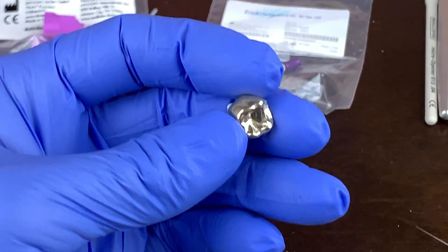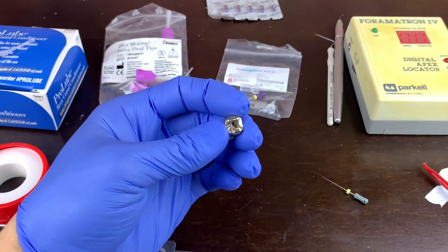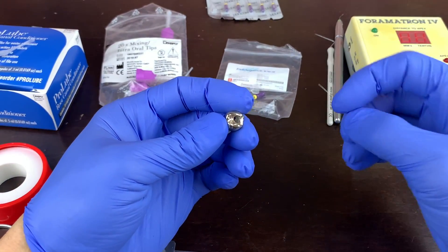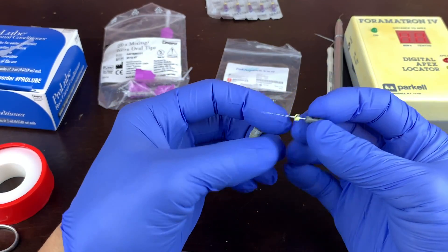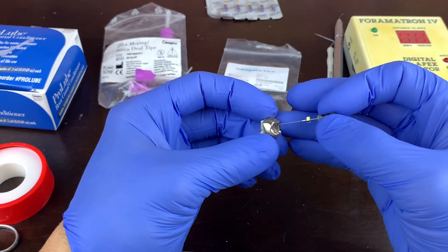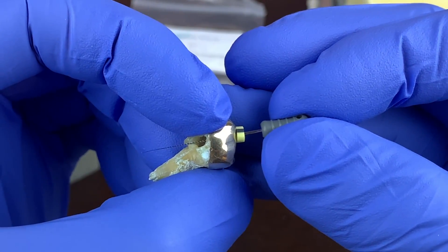So you've got your gold crown and it looks something like this. A couple of these techniques work really well with this. The first one I'm going to show you is a really simple one. You don't have to have any extra tools, but you kind of have to have a decent enough access. What we're going to do is place our rubber stop and we normally measure our working length from the bottom of the rubber stop.